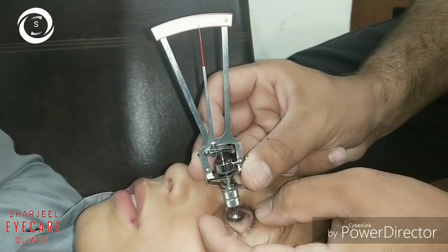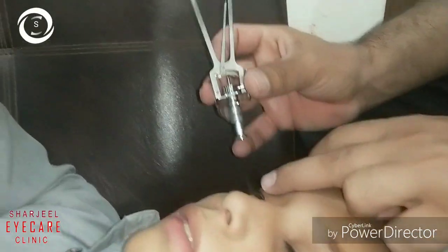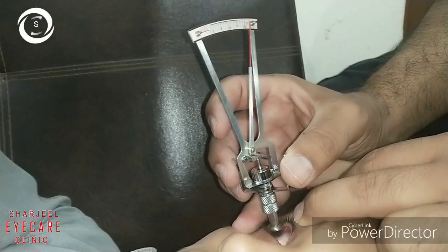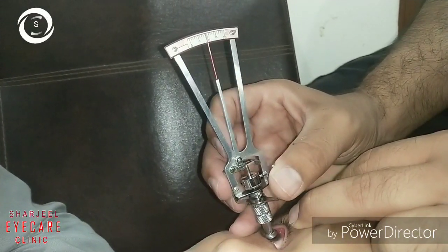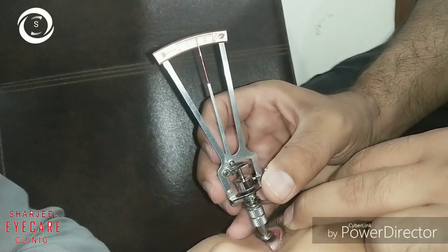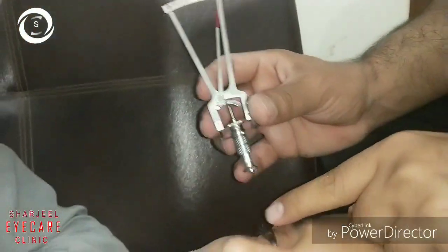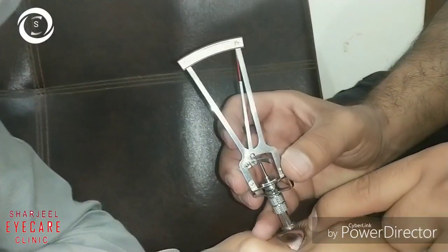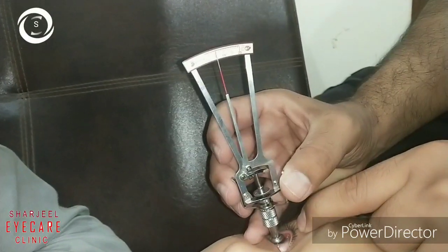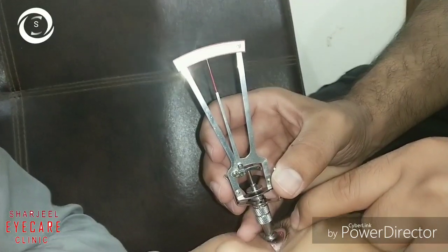All four times on the left cornea the reading is the same. Make sure the tonometer is not inclined and is held upright. On the right eye with the 10-gram weight, taking three or four readings, the reading is 11. Removing the weight, the reading is six, three or four times. This patient had normal intraocular pressure when compared on the Schiotz calculation chart.